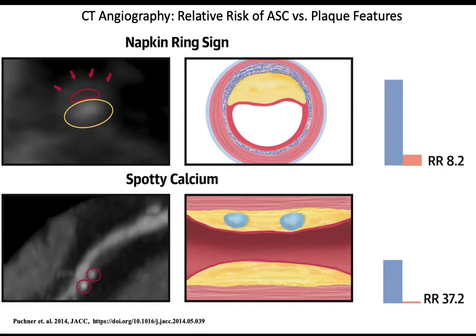So if you had to draw what your coronary angiogram looks like, you can think of a scenario in which it's over or under 50%, has calcium or not, has lipid or positive remodeling. You go through the checklist as the radiologist is describing the picture, adding up the risk in your mind. It doesn't necessarily add up linearly, but these are all different risk factors.